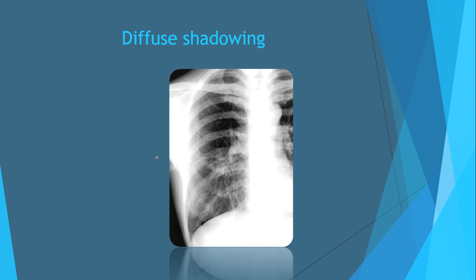Diffuse shadowing. We have a shadow, it's diffused, we have reduced level of pulmonary vessels, so it's diffuse shadowing.